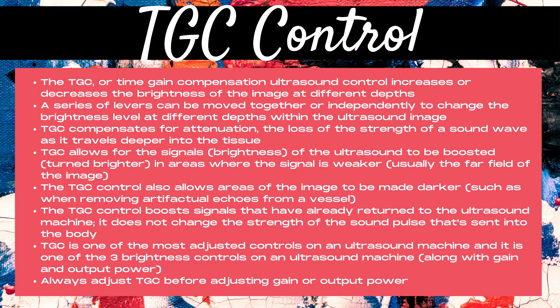The TGC, or Time Gain Compensation Ultrasound Control, increases or decreases the brightness of the image at different depths. A series of levers can be moved together or independently to change the brightness level at different depths within the ultrasound image.